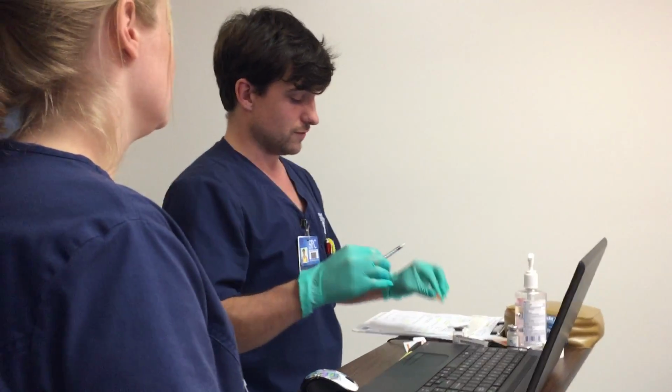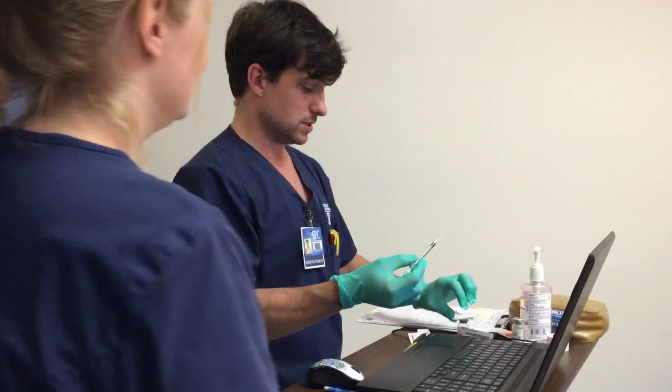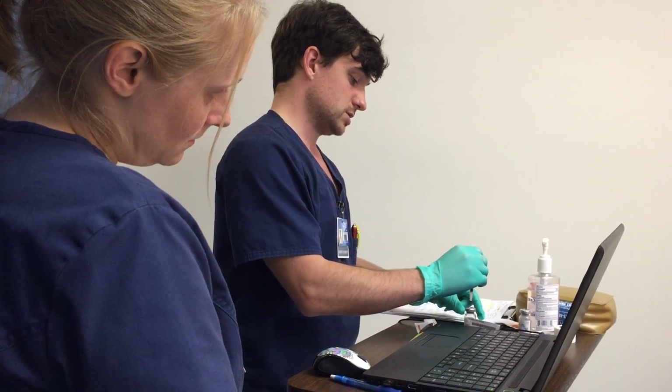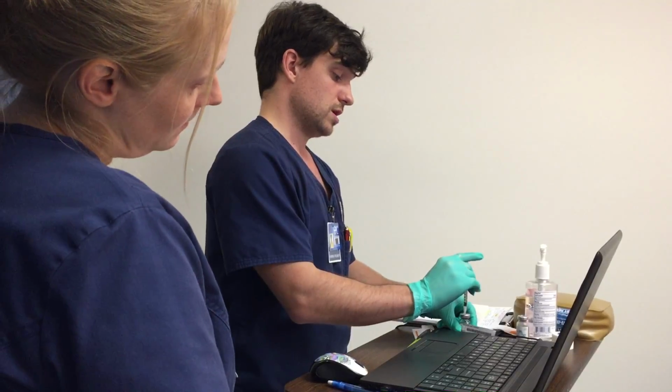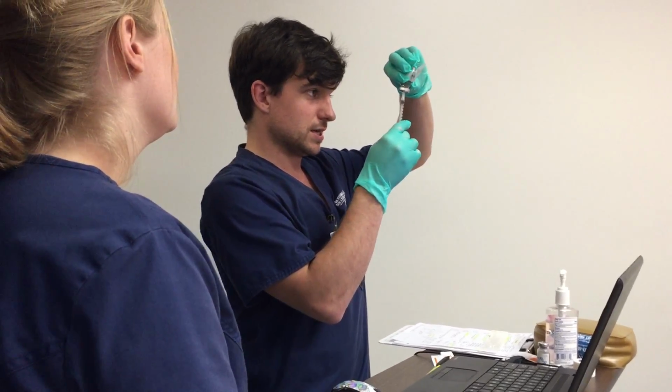I just want you to verify that that's 6 units. Yep. Perfect. So now we're going to inject 6 units of air. That way we can actually draw back the actual insulin. And draw back 6.